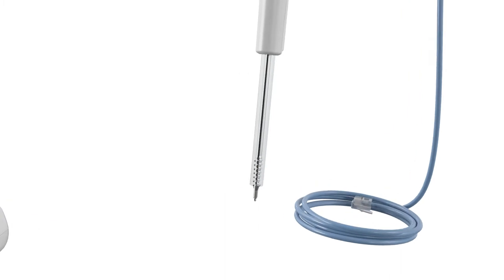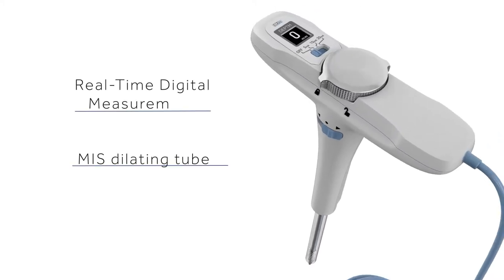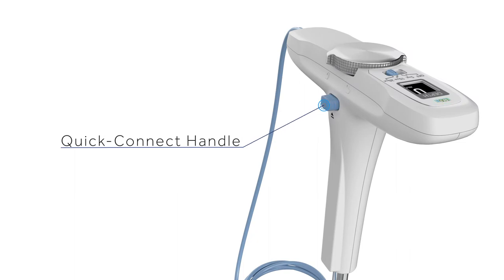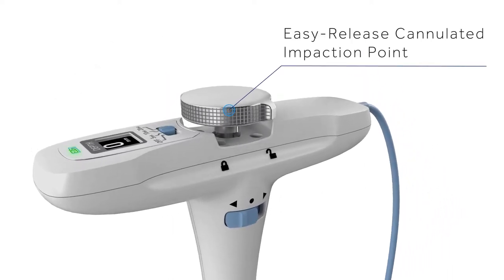The Awl-in-One Tap has a leading awl-tap for creating a quick and controlled screw-hole pathway. It also has an MIS dilating tube with real-time digital measurement and triggered and continuous EMG neuromonitoring, a quick connect handle with ratcheting capabilities, and an easy-release cannulated impaction point.